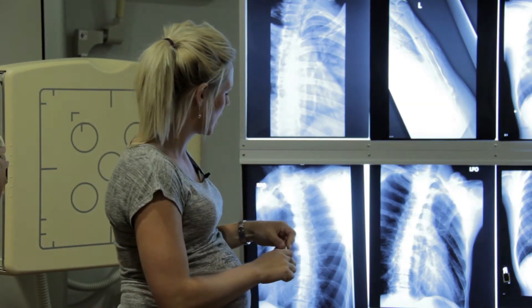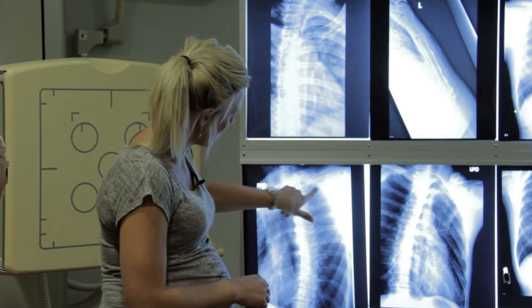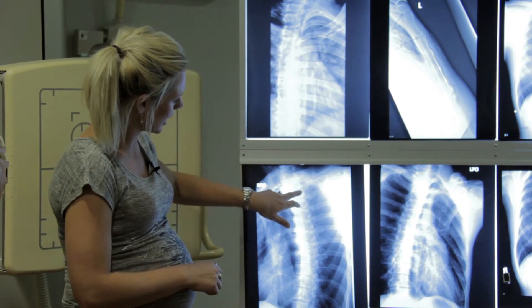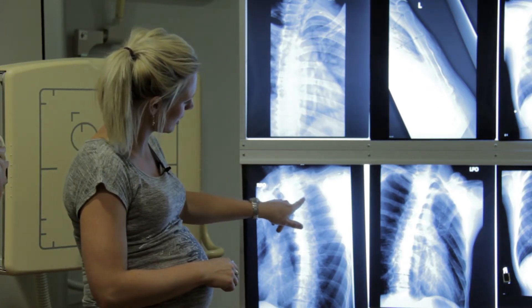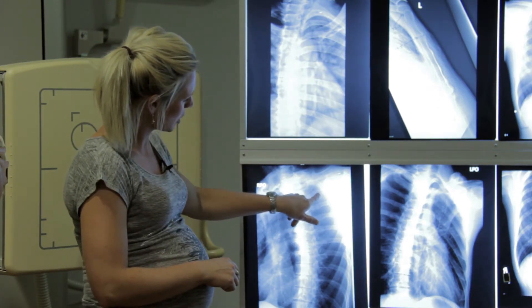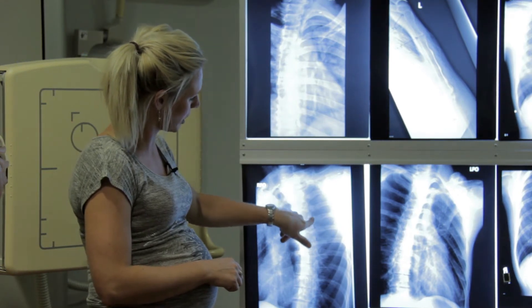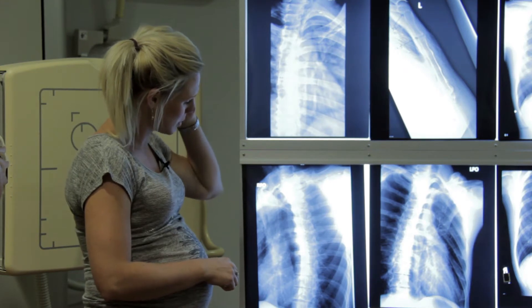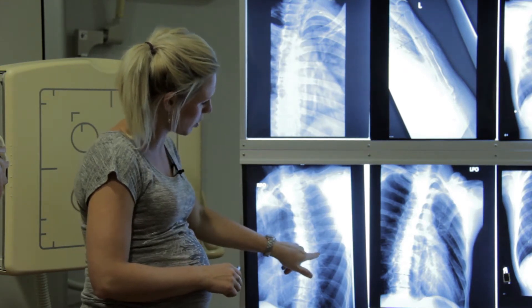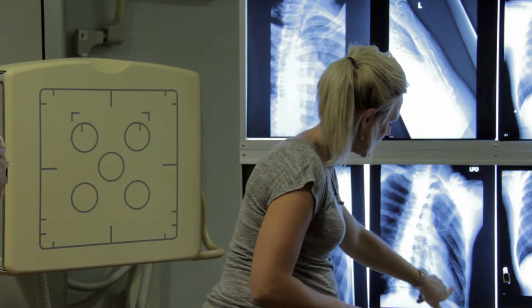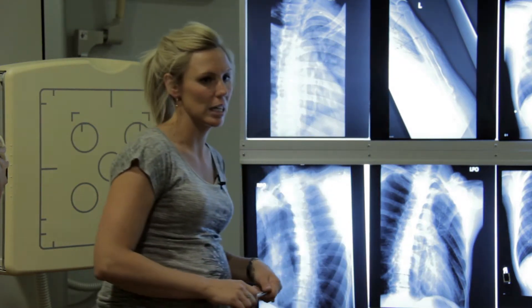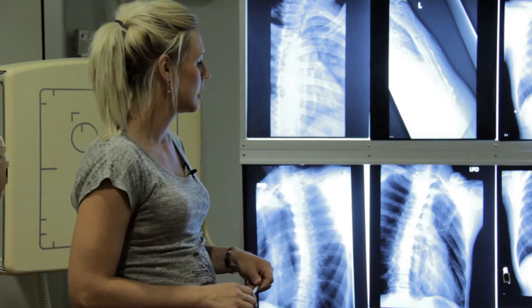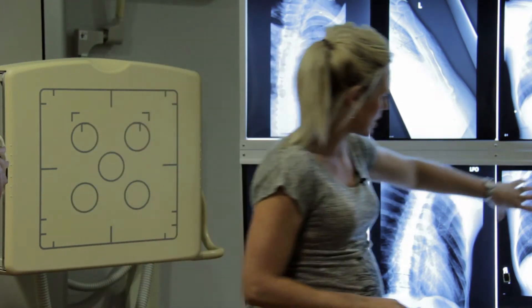On this one we see them all cross over, but what we're really focusing on is the articulation — we can actually see where the head articulates with the vertebrae and where the tubercle articulates with the transverse process all the way down. Good amount of obliqueness here, maybe could have used just a slight bit more. But this one definitely needs more — when you're seeing big curls like that, we didn't really accomplish the goal.